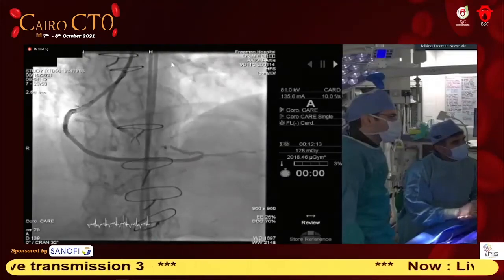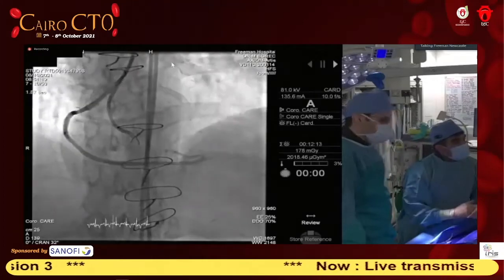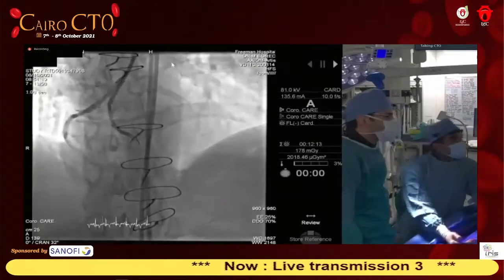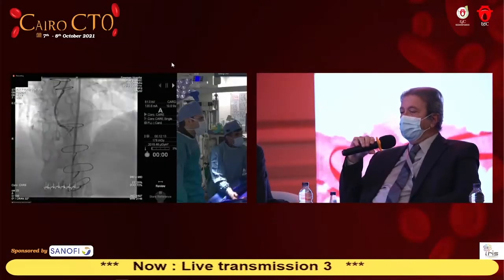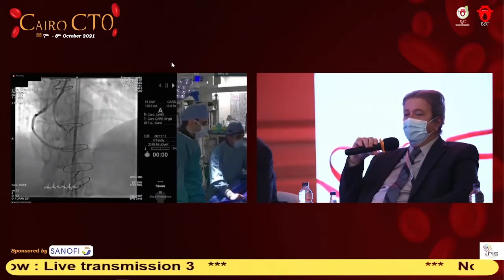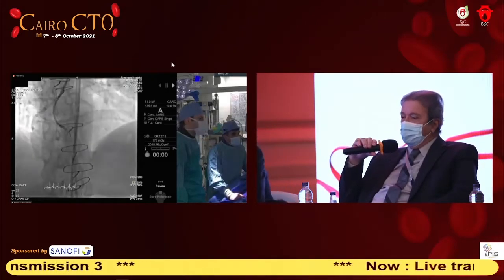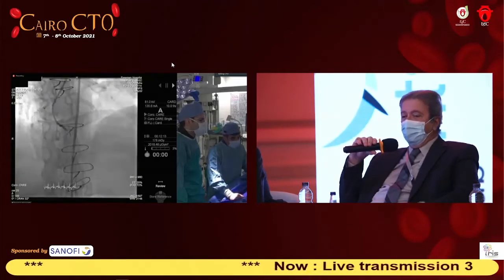Again, at this age, I think it's probably worth doing this, but that's my view. And you know, Mohamed, we were just discussing yesterday that retrograde approaches should be done by experts, because if you do a retrograde and you don't have enough experience, you might go into trouble. I think with your experience, retrograde is never easy, but the success rate will be higher if you have good experience.